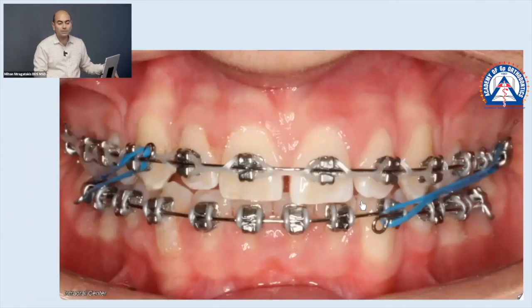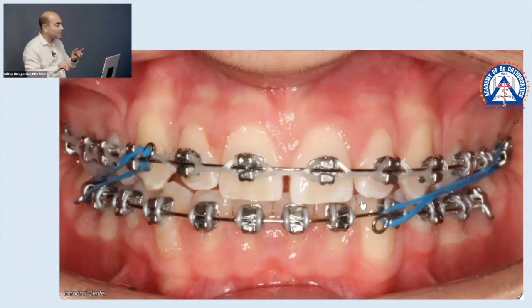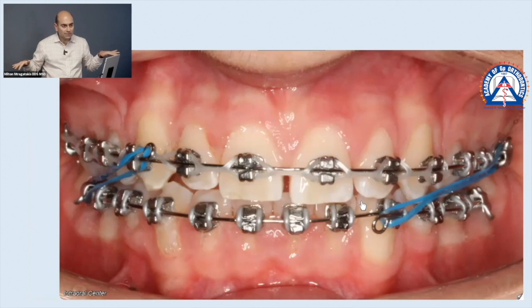And now we're starting to close spaces, right? And what type of elastics do we use? Midline elastics. Because when is the best time to correct your midline? Space. When you have space in stage 2. This is purely dental. We're holding the upper right canine back as we bring the power chain to close the space, and we're holding the lower left canine back as we're trying to correct the midlines.